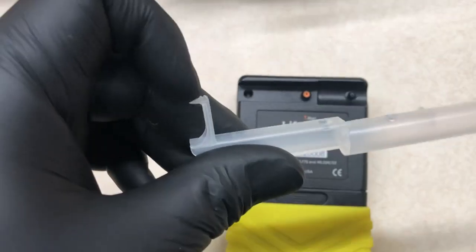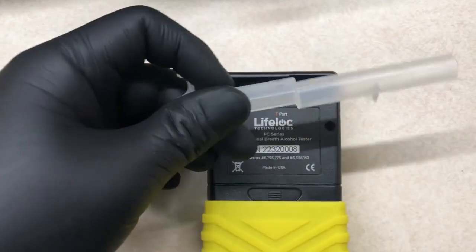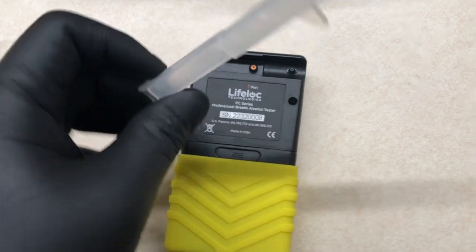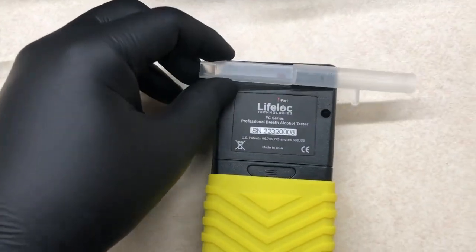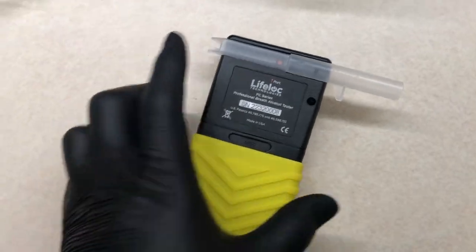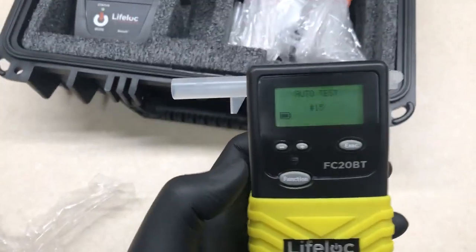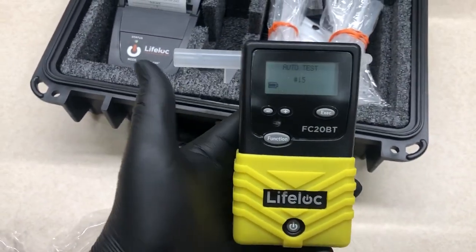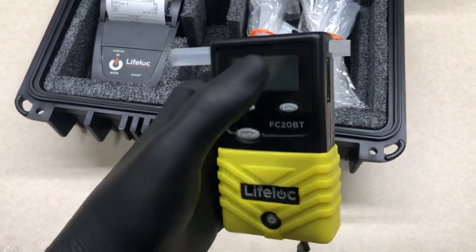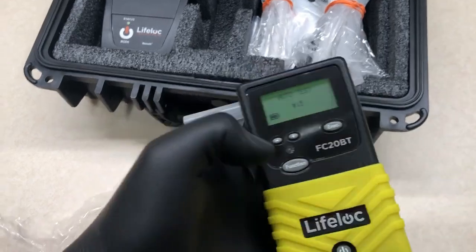And the little edge here is going to go away from the left-hand side, I believe. Okay, so you're going to go ahead and just push those in. It doesn't make a clicking noise or anything like that. And then now you're going to have it this way. The straw that's going to the patient is going to be facing the left, and then the detaching little lever is going to be on the right-hand side.